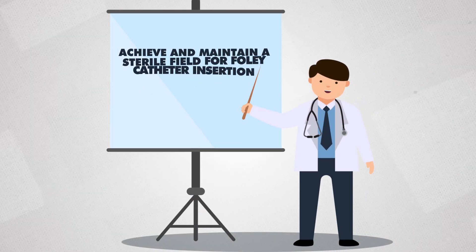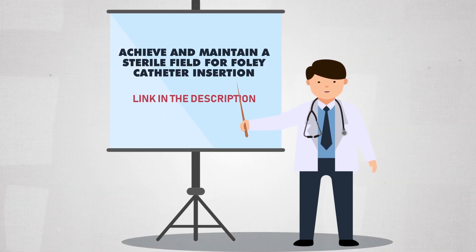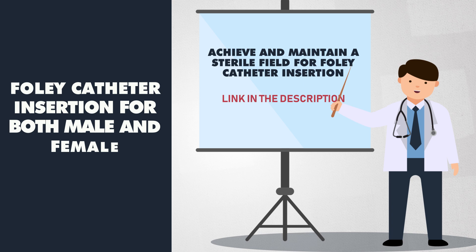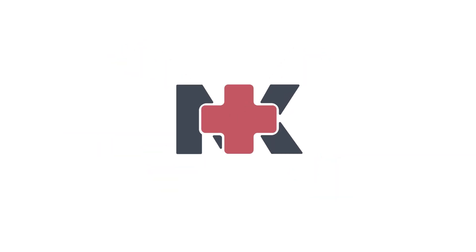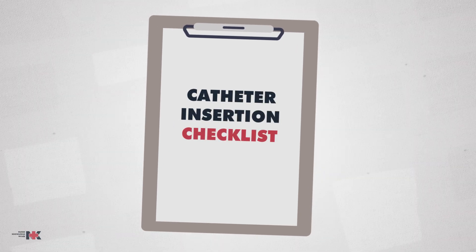As we discussed in the previous video how to achieve and maintain a sterile field, we are now ready for Foley catheter insertion for both male and female patients. But before we start, let's check important points using this checklist.